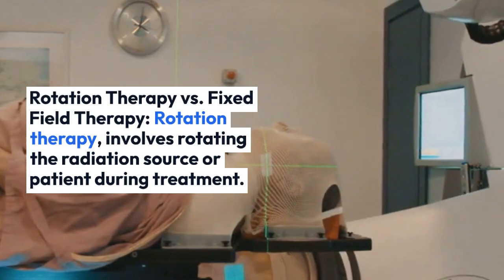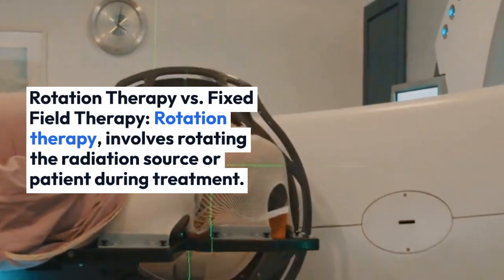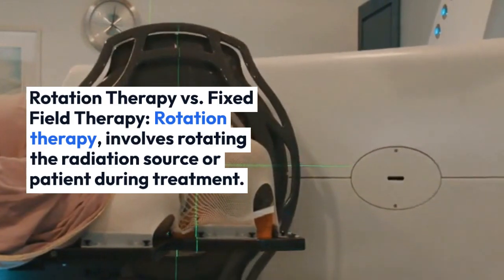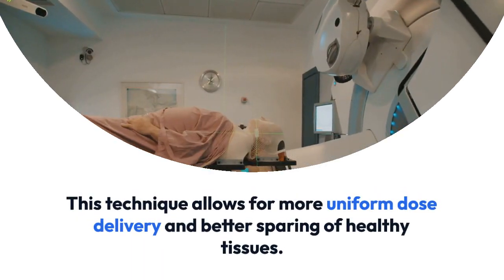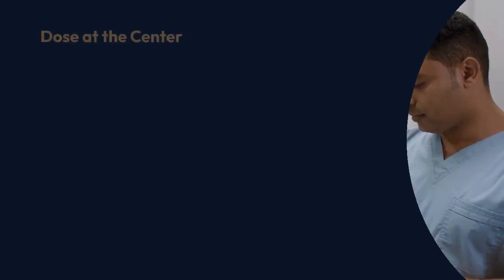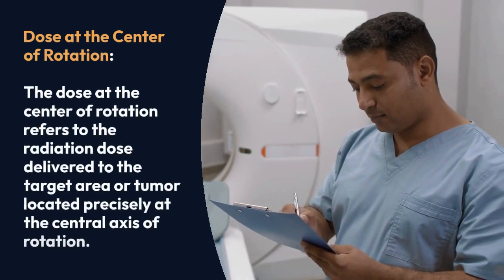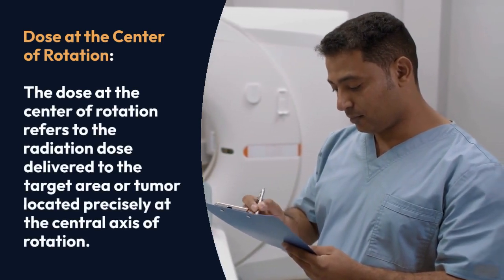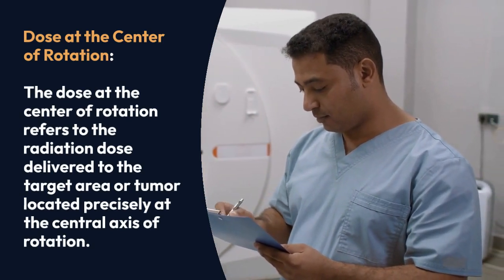Rotation therapy versus fixed field therapy. Rotation therapy involves rotating the radiation source or patient during treatment. This technique allows for more uniform dose delivery and better sparing of healthy tissues. Dose at the center of rotation refers to the radiation dose delivered to the target area or tumor located precisely at the central axis of the rotation.